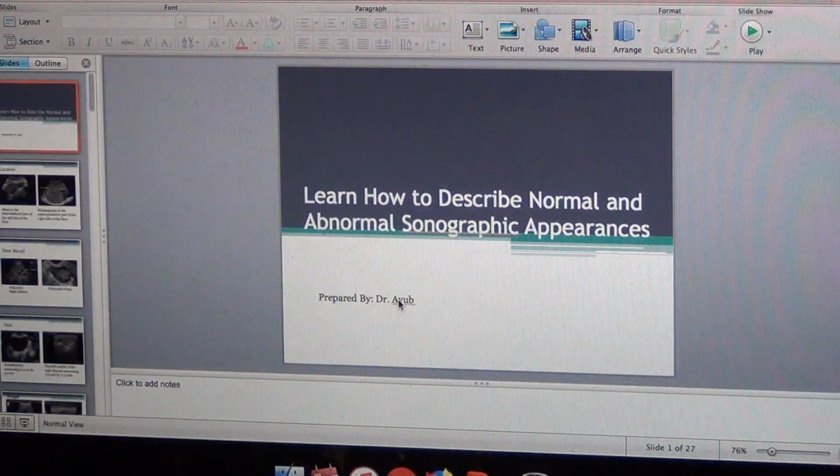Okay, so that was actually my collection right now, and I tried to give you a lot of information about the sonographic appearance of the organs, normal versus abnormal, and I hope you're going to practice it in your daily job and practice life, and you will see if you practice in this way.